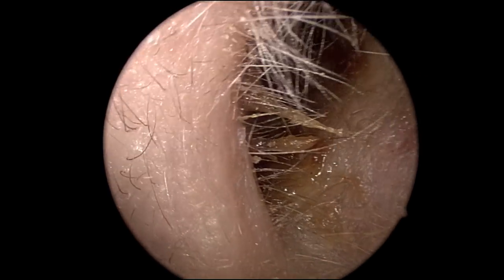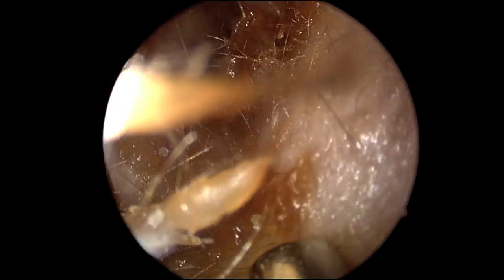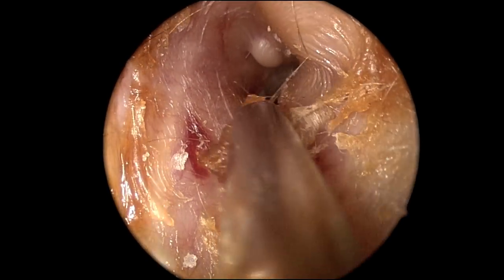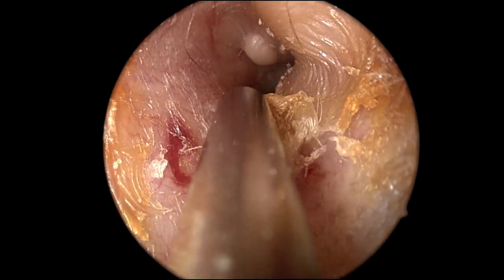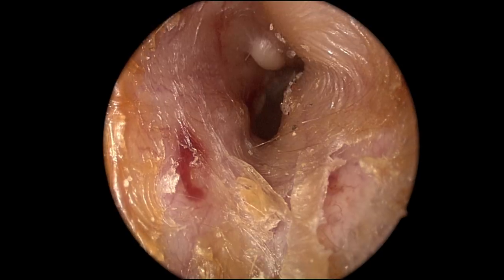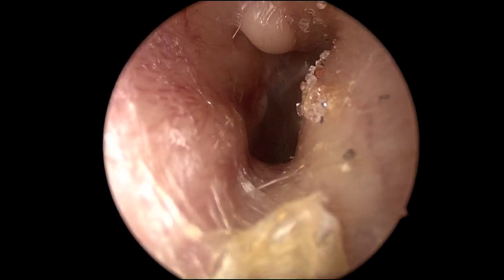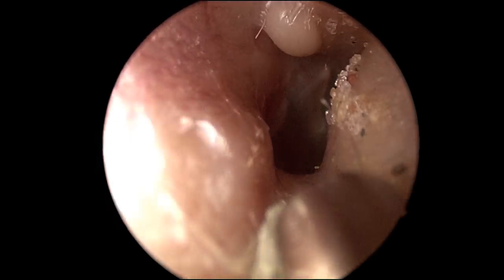Here we are examining the right ear canal. We can see obstructing cerumen laterally. A suction is used at this time to try to remove some of the canal contents. You can see the skin is very dry. Further in, you see an osteoma superiorly.